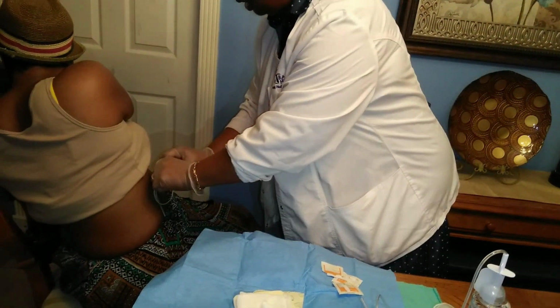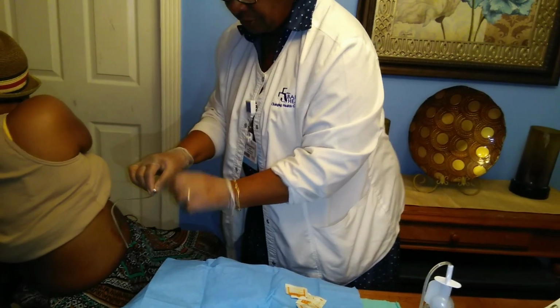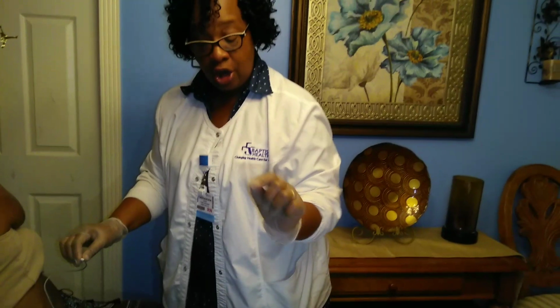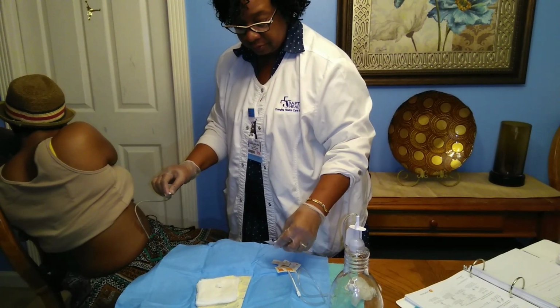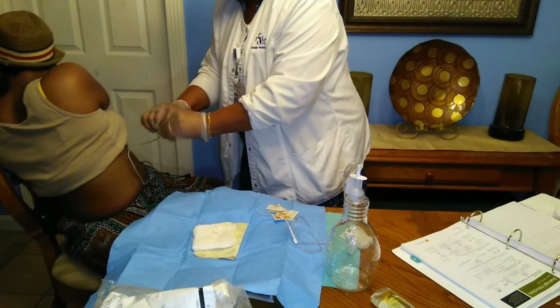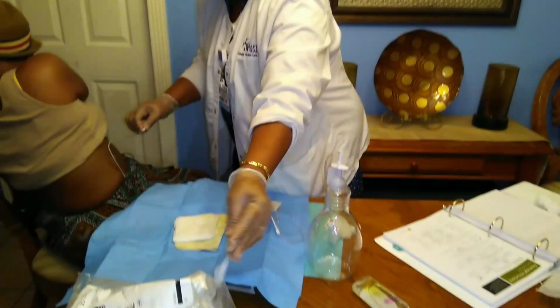And there's a cap that's on this catheter. I take the cap off and throw it in the trash because I've already opened my new sterile cap that's there. I take my first alcohol pad and clean where I removed my cap. Throw it in the trash.